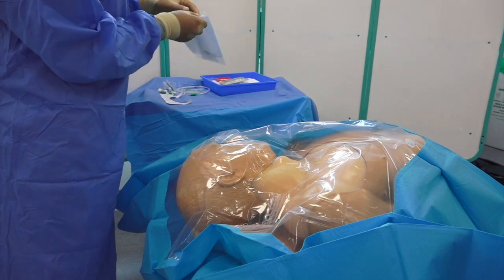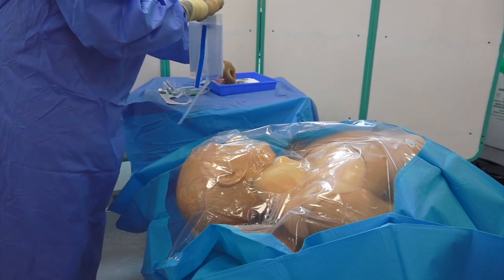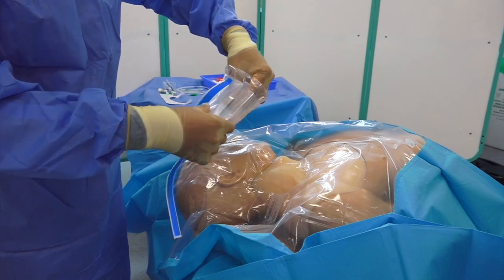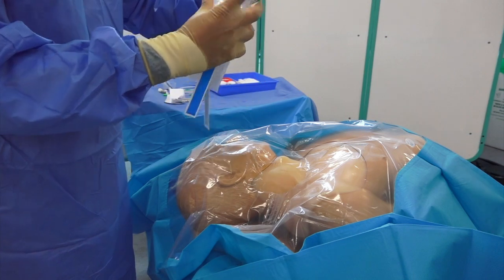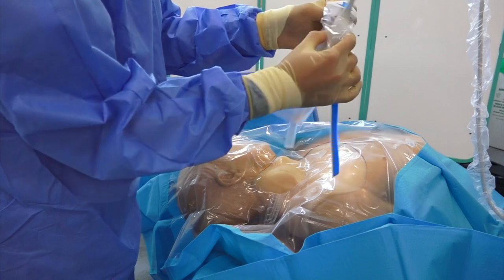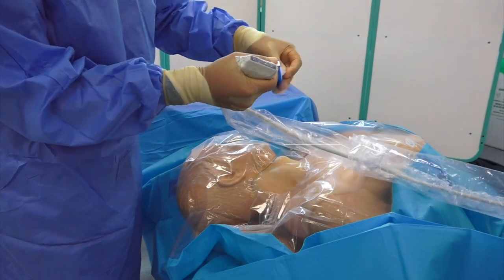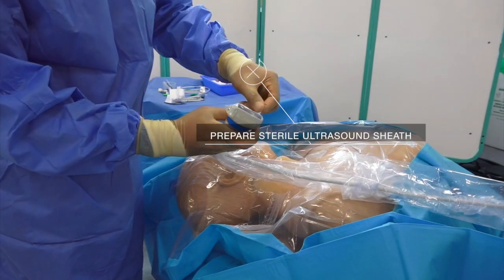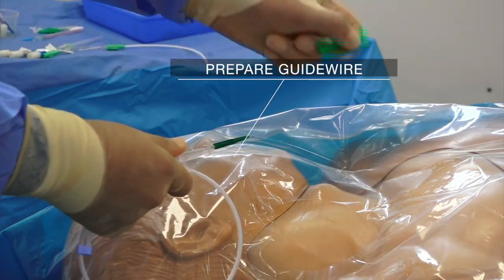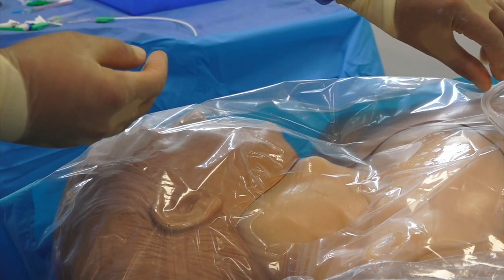Prepare your equipment for cannulation. Have an assistant help you apply a sterile ultrasound sheath to your ultrasound probe, remembering to insert sterile ultrasound gel into the sheath before applying. Do not touch the probe with your sterile gloves while applying the sheath. Secure the sheath to the probe. Prepare the guide wire by removing the cap covering the tip and withdrawing the wire in the introducer sheath until the J shape is no longer visible at the tip.